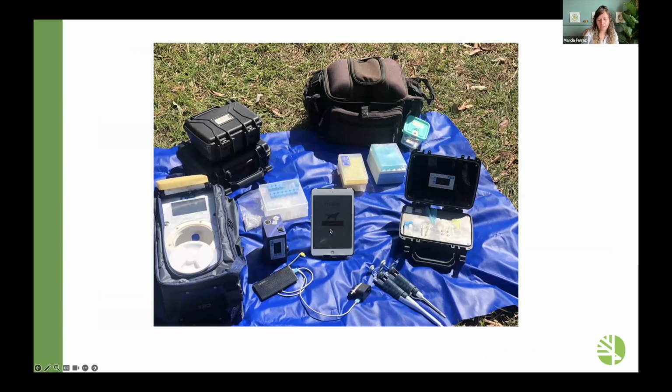But we still lack a lot, especially when we collect semen. We need to wash away the seminal plasma and replace it with the extender and the cryoprotectant solution. And it's not possible, because then you have to bring a centrifuge and other equipment to the field, which makes it difficult. So that's why came the idea of producing devices in which we could wash and select the sperm in a field setting. That is what I'm going to start with first, and then next I will talk about the oocyte side.